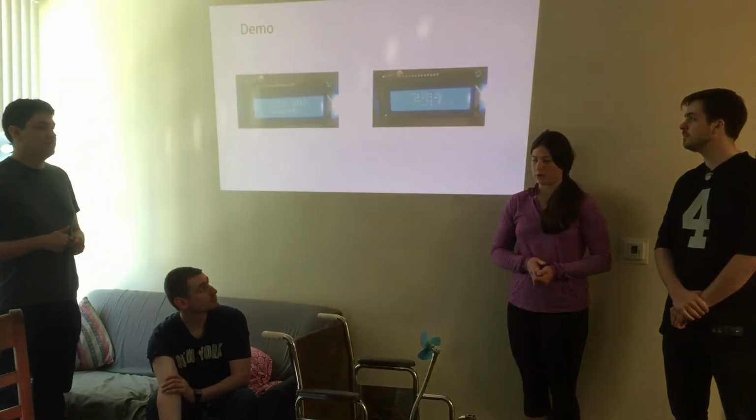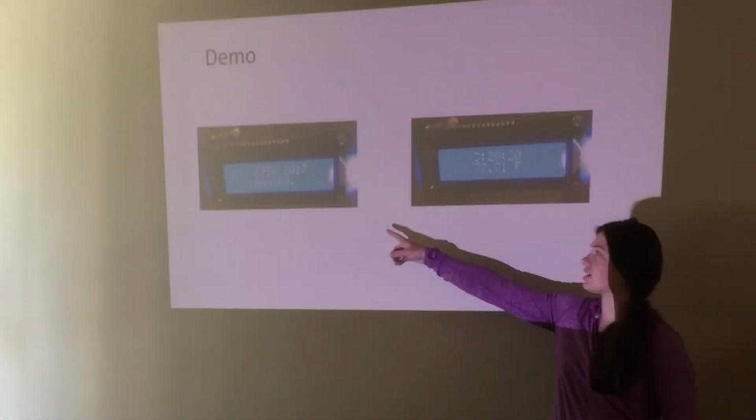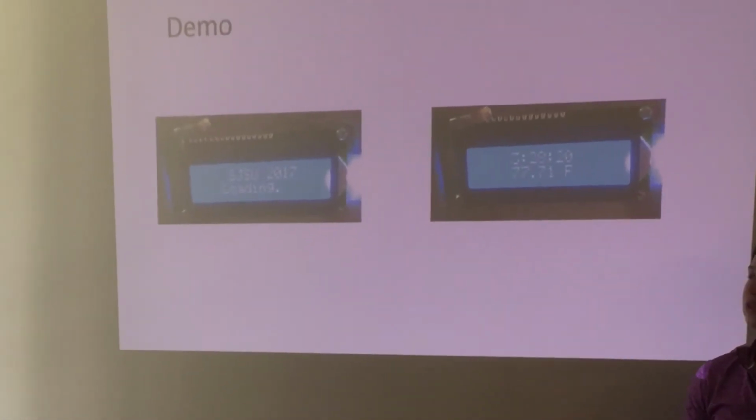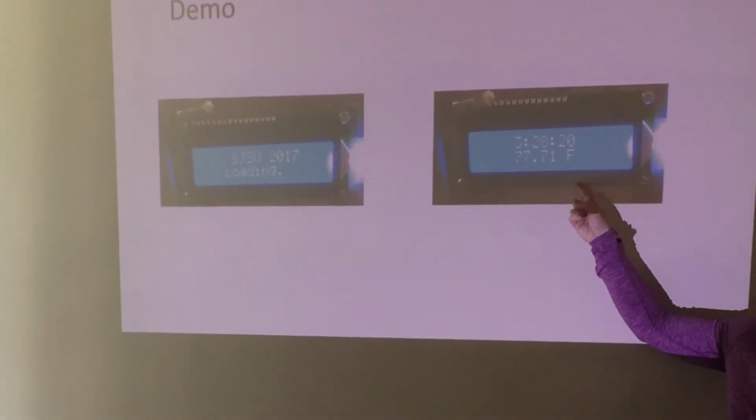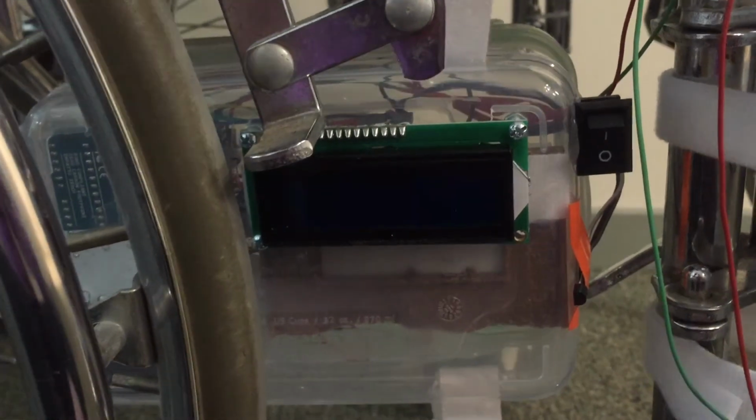So now we're going to demo our project. When the project first turns on, it says SJSU 2017 and it shows that it's loading. Then once the temperature sensor has a good reading, it will display the time as well as what temperature it is. Here is a demonstration of what the LCD display shows as it goes through the temperature readings.